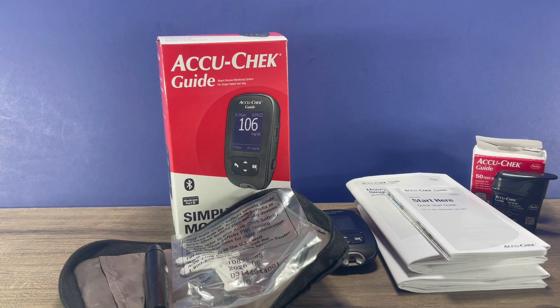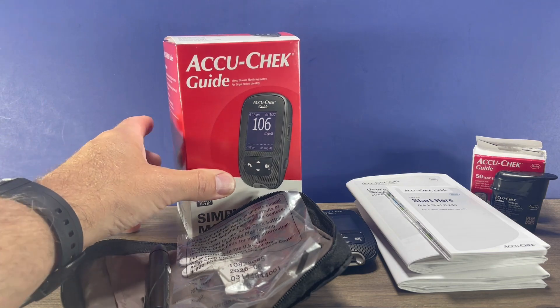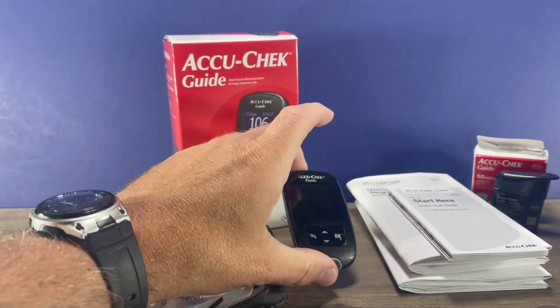Hi, this is Josh, pharmacist with Learn Blood Sugar Testing. I'm going to take a look at the AccuCheck Guide and show you how to set up and use this glucose meter.